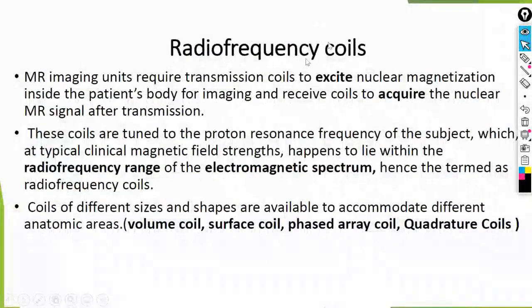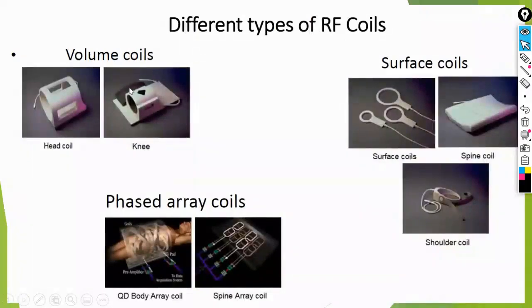The third need is the radio frequency coil and RF pulse. The RF pulse can be 90 degrees or 180 degrees. As the flip angle increases, the amount of energy deposited in the body also increases. Therefore, all sequences that use 180-degree pulses, such as spin echo, result in high energy deposition within the patient compared to those that do not use 180 degrees.